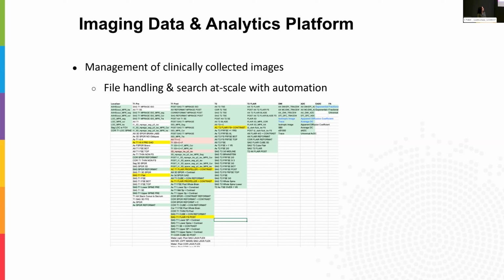But typically what's done is a researcher will collect all this data and be faced with figuring out for themselves which files based on these file names correspond to which of these types of images. So really, to empower researchers when you start dealing with 200,000 images is the need to be able to start grouping and classifying images and making it much more queryable and usable.